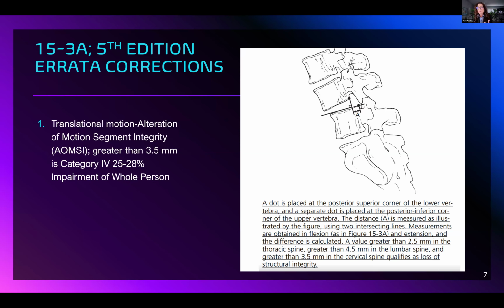And yeah, it might individually look subtle or mild with flexion, but when you add those values together, it's huge. That's what I see most often: they just go, there's a little bit of this and mild this, and they don't use the measurements. Also, they don't know how to measure it when they do try. And again, that's why I'm pointing this out with this diagram.